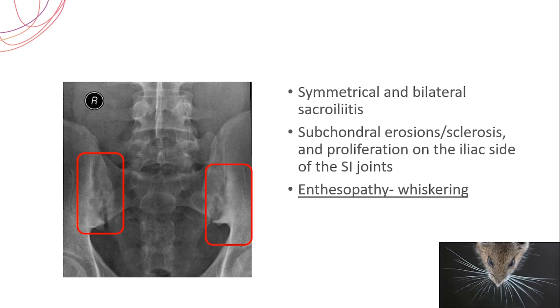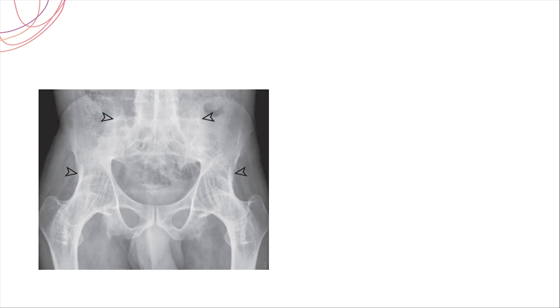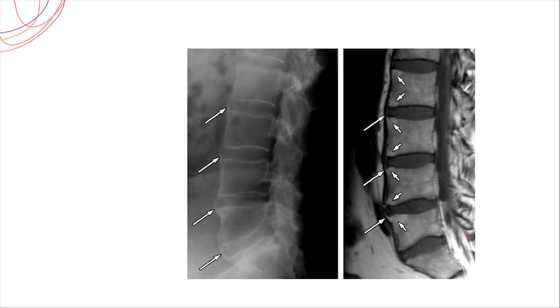If sacroiliitis is allowed to progress, it will end up with narrowing and fusion of the joint, as seen in this picture where you cannot find any sacroiliac joint. Even the bilateral hip joints are fused.